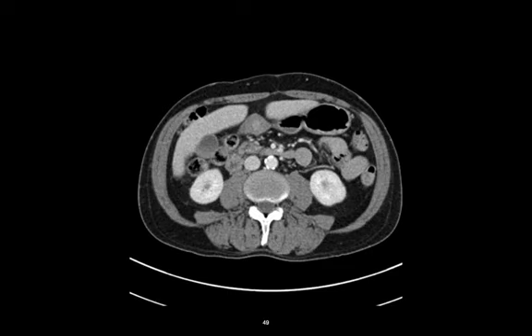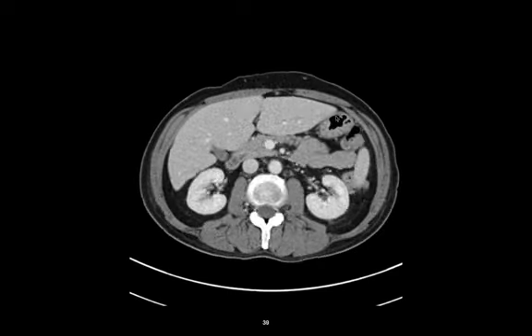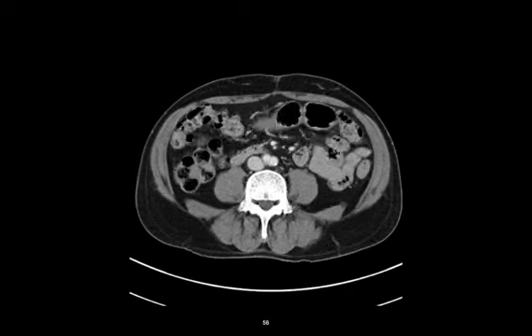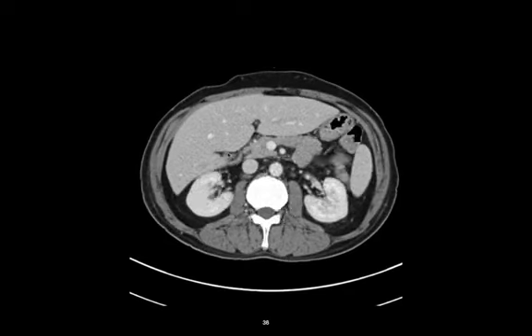Okay. Next is the abdominal organs, like where our stomach is. And so here's our liver, and there's where the stomach is going to be in this patient. And now where the duodenum is going to be. There's a couple of ways I find the duodenum.